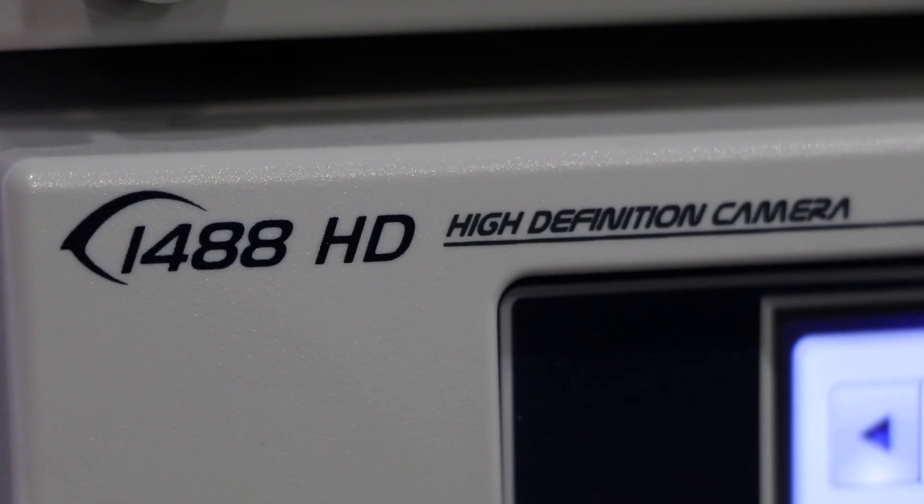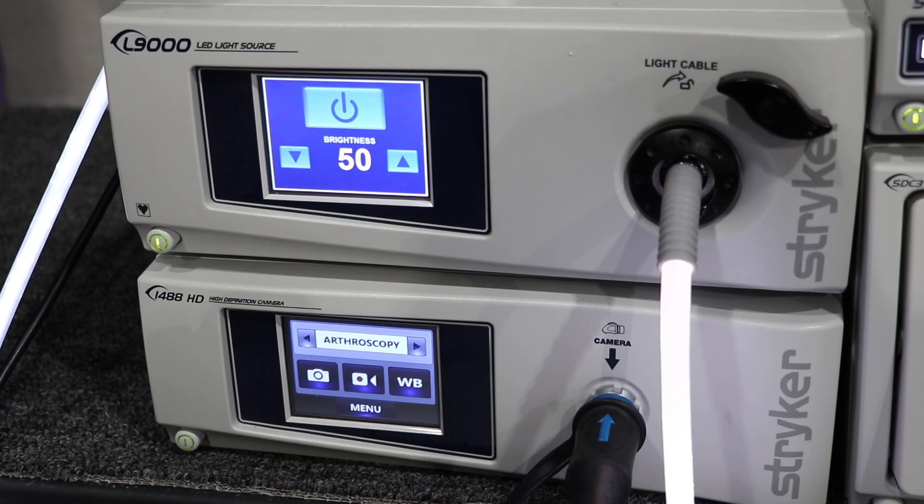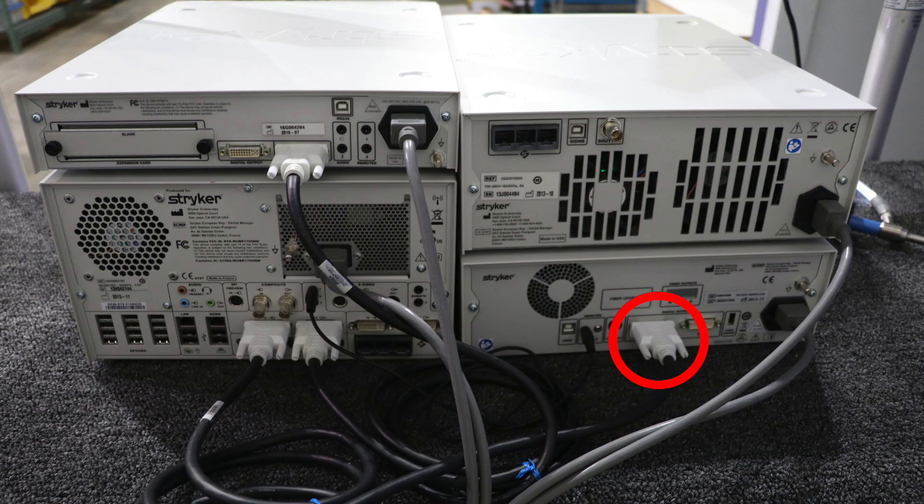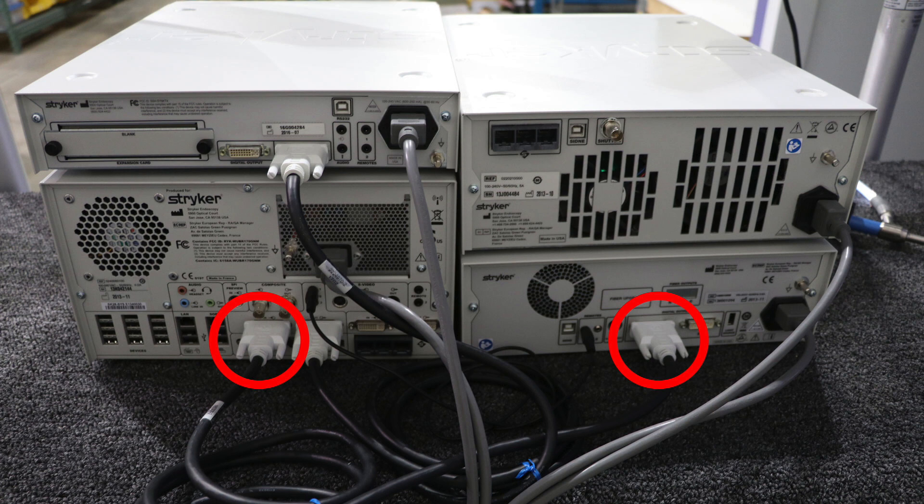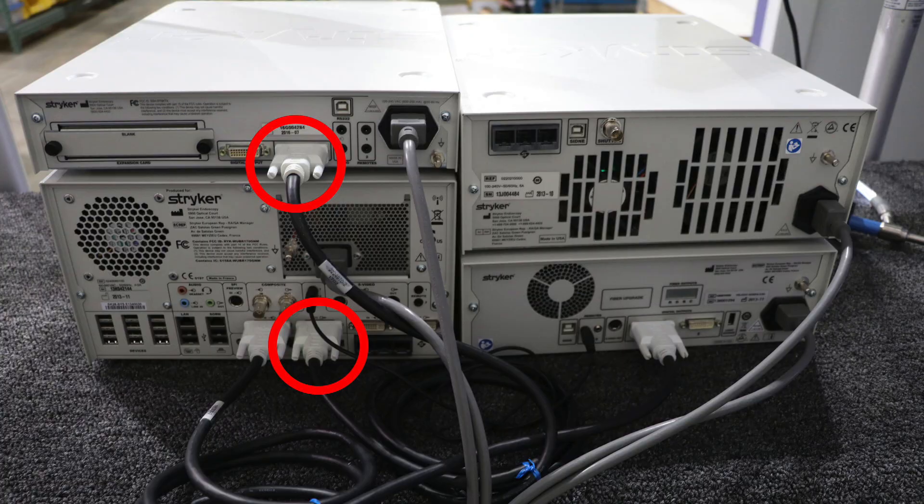Camera video signal always starts at the CCU or camera control unit. It then goes DVI from the camera control unit to the SDC, which is the Stryker digital capture, then from the SDC to the transmitter, which is a Synk wireless transmitter.